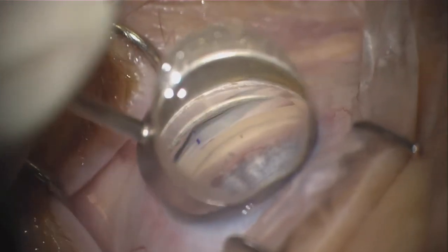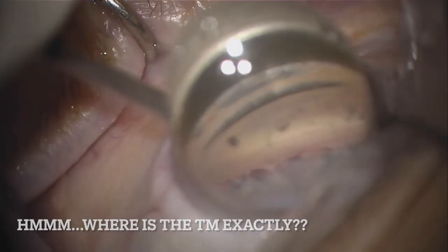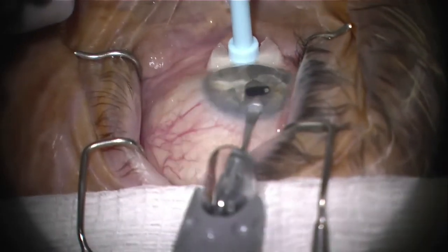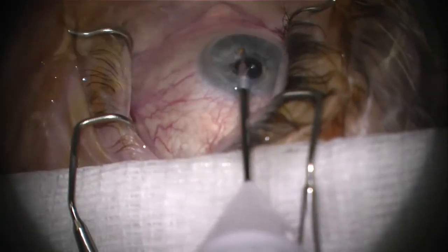If you have anatomy that is well pigmented, you can easily see the trabecular meshwork, but sometimes the trabecular meshwork may be lightly pigmented and what may be more pigmented is the ciliary body or the ciliary body band. In order to tease this out when it is confusing, try to find pigment or heme — these indicate the trabecular meshwork, and I see it here. One way to help highlight a lightly pigmented trabecular meshwork is to either remove viscoelastic or aqueous humor from the AC to lower the pressure in the eye. After temporarily lowering the pressure, when you go back into the eye and repressurize it, you will see with a gonio lens that there is reflux blood in Schlemm's canal. The reflux of heme highlights the location of the trabecular meshwork and will allow you to orient yourself to the patient's anatomy.